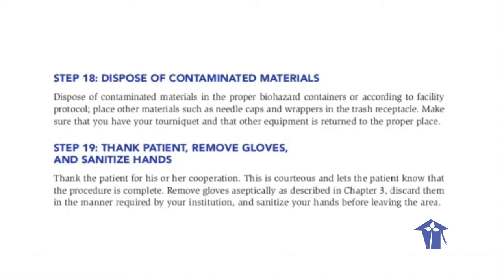Step 18. Dispose of contaminated materials. Dispose of contaminated materials in the proper biohazard containers or according to the facility protocol. Place other materials such as needle caps and wrappers in the trash receptacle. Make sure that you have your tourniquet and that other equipment is returned to the proper place.